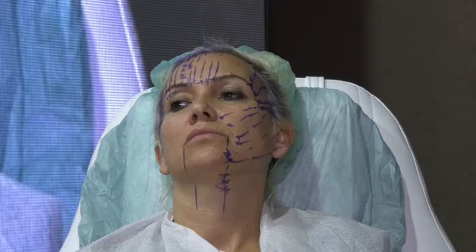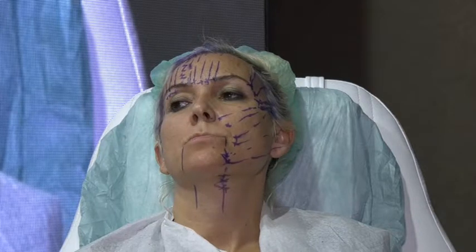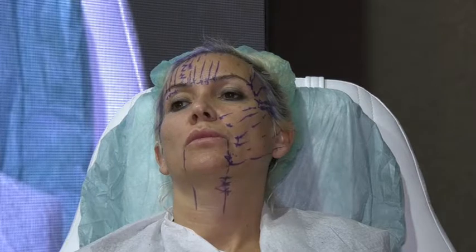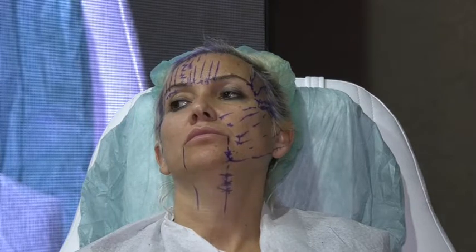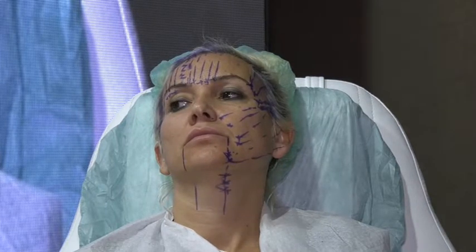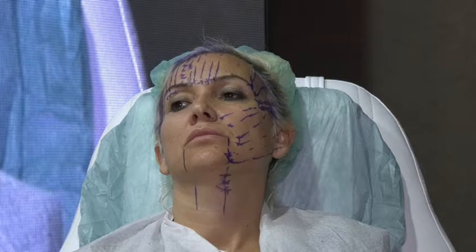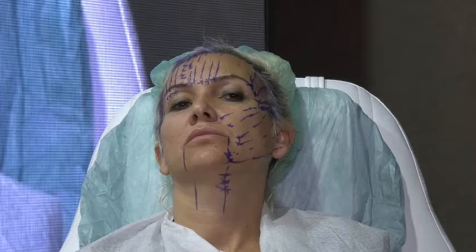You want to add more threads if you have a lower neck. Dr. Hanadi attended a case with me in the hair clinic. The doctor, he is a dentist, had a big laxity in the lower neck. But did we put any threads in the lower neck? No. We stopped at the hyoid bone, but we put 5 or 6 threads in this area. And it lifts the lower neck, because when you lift up, it takes all the down with it, but not the opposite.